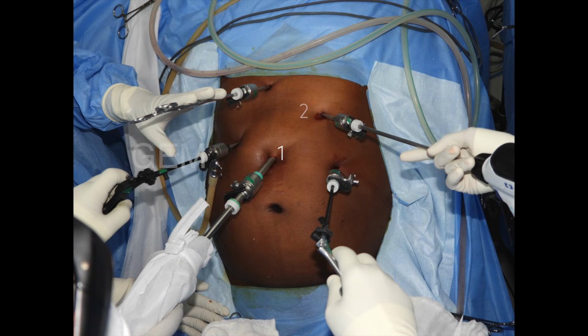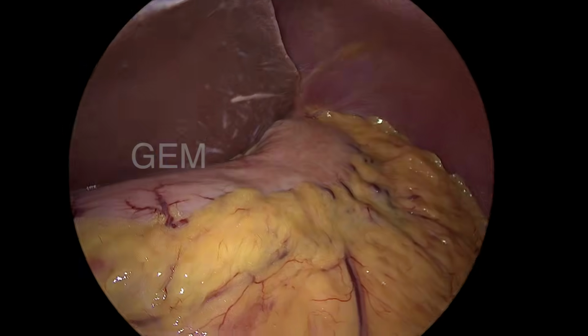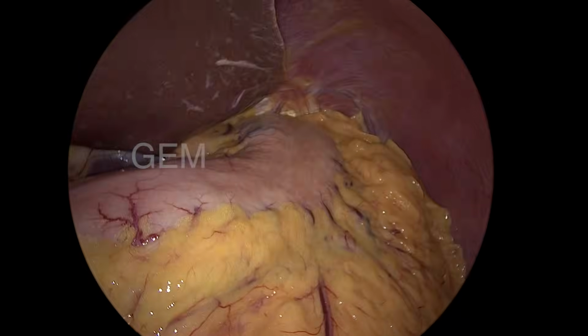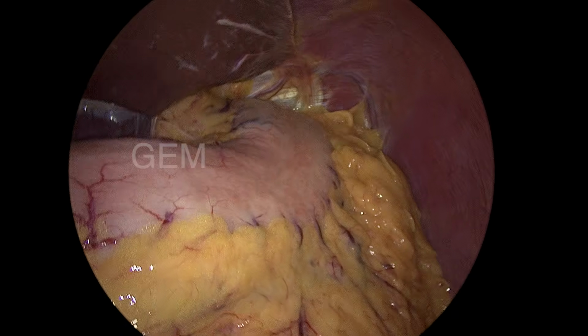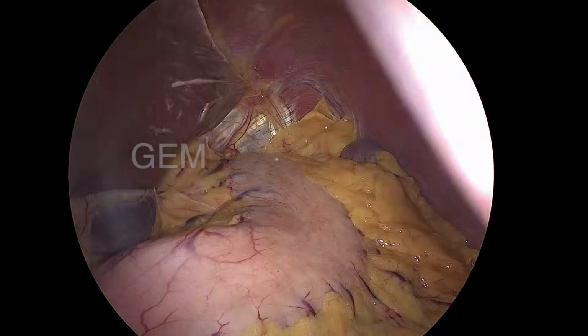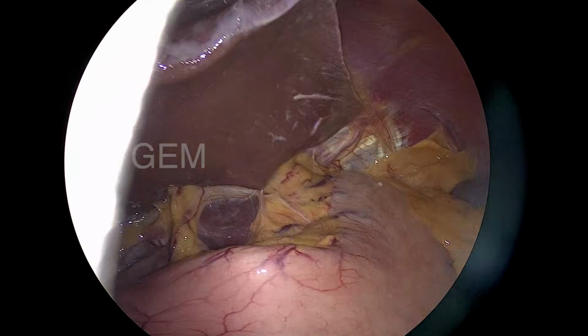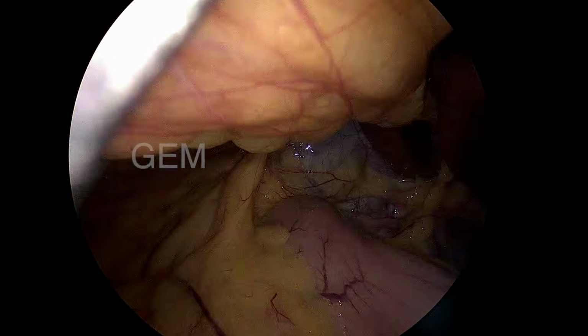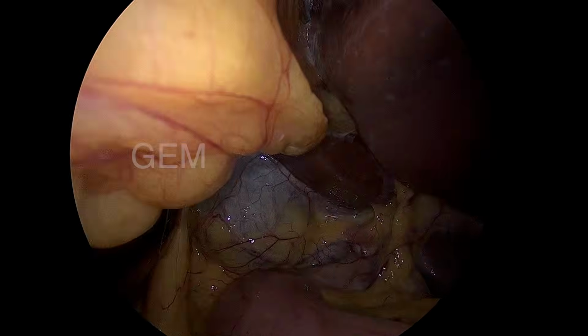So, this is the supraumbilical camera port, right hand working, liver retraction, left hand working and stomach retraction. All 5 ports is the standard for any upper GI surgery or transhiatal surgery, and head end up is done. This is the supraumbilical port camera view on the OG junction. This is the right hand working port from left subcostal. So, this is the right subcostal close to camera.